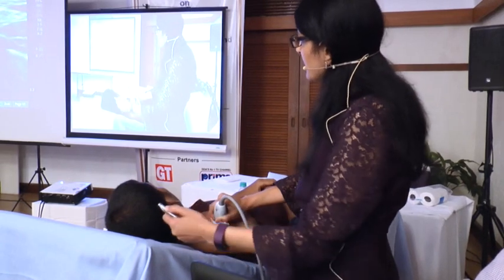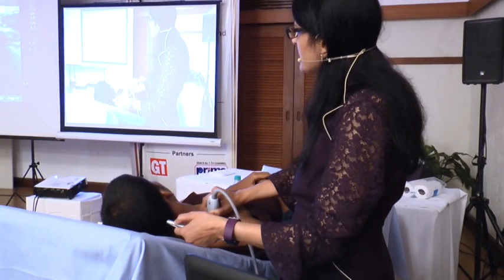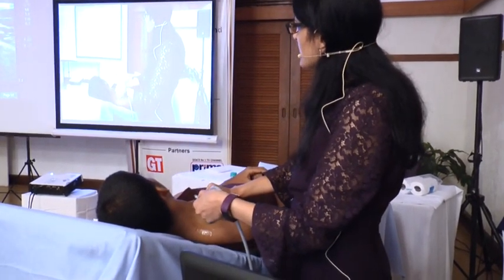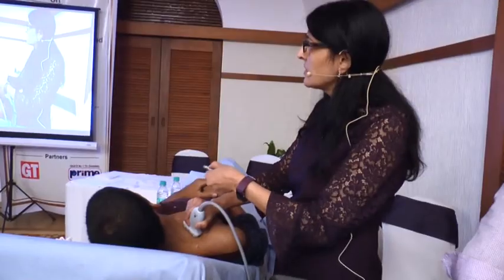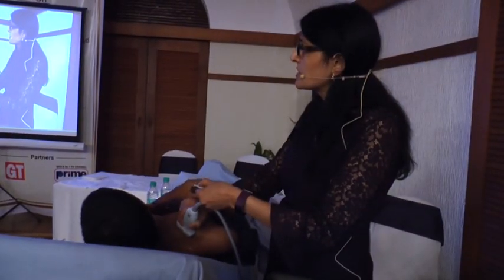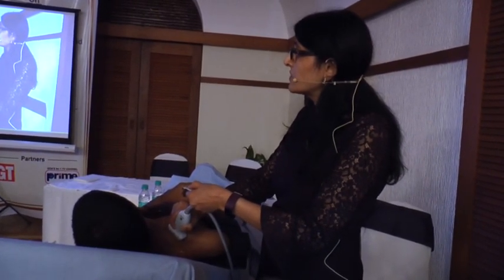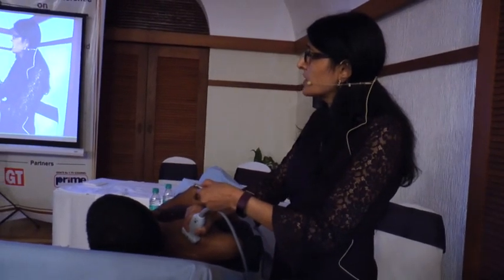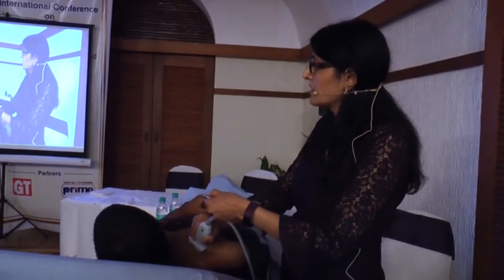Okay, take a deep breath, please. So now when the patient takes a deep breath, you can see the sliding motion of this pleura, which is that one. Okay, and you can locate your visceral pleura there. From the lateral aspect, make sure you deposit the local anesthetic in this corner pocket as well to cover your ulnar territory. And I usually reposition the needle again to make sure that I've got enough spread of local anesthetic within the sheath at the top and laterally.